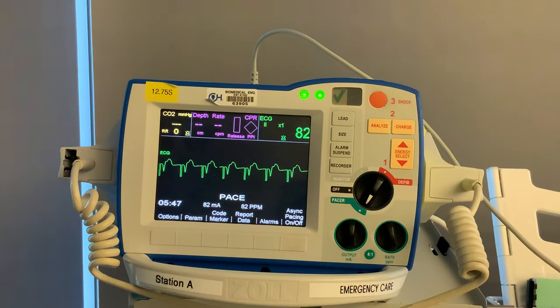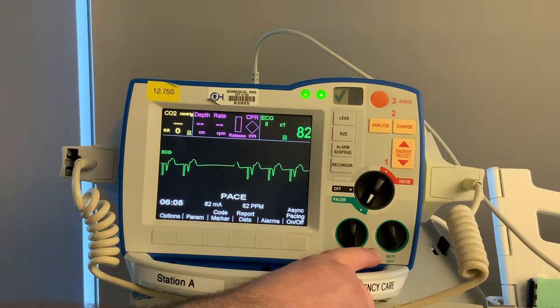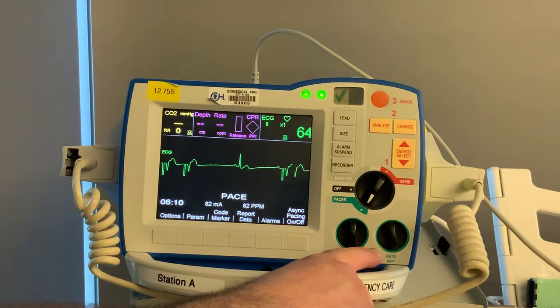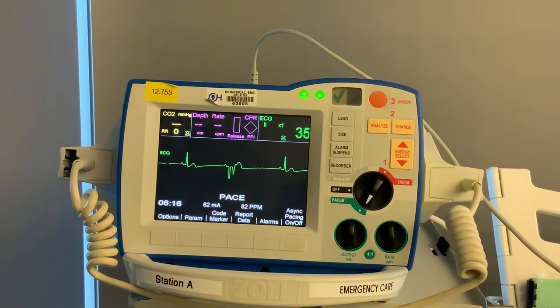Now we have capture on the monitor. If you see this, go back and reassess your patient to make sure their pulse correlates with what's on the monitor. Now our patient is being paced. If the physician comes over and wants to see the underlying rhythm, we're not going to turn it off — we're going to hit the 4:1 button and hold it in. It will take away three out of four pacer spikes, showing you the underlying heart rate and rhythm. The second you let go, you're back to being paced normally.